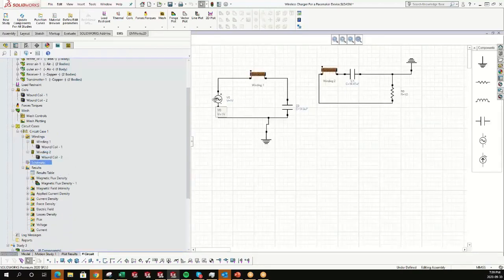Here is our source, a sine wave source, and we have the coils, our winding, and this is the resonant capacitor. The value of the resonant capacitor is computed using the resonance formula, and here is also the receiver circuit. So we have a resistive load of 1 ohm.